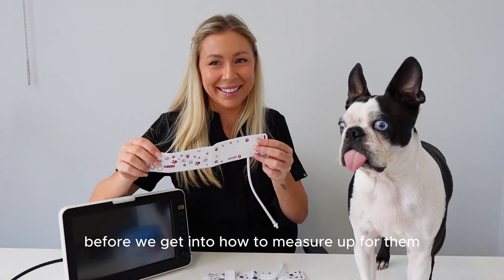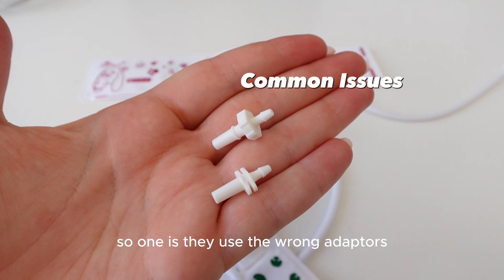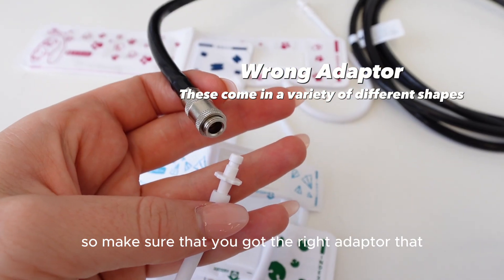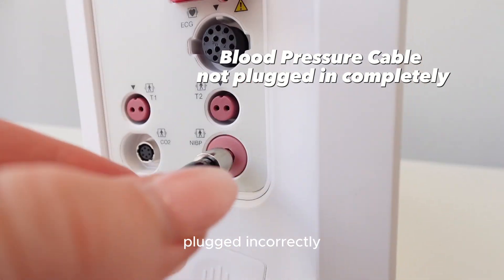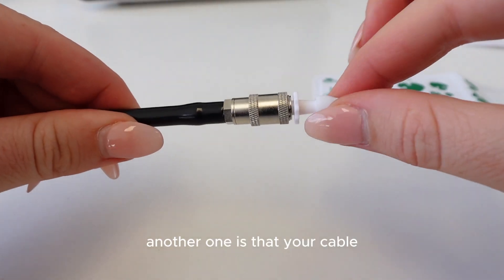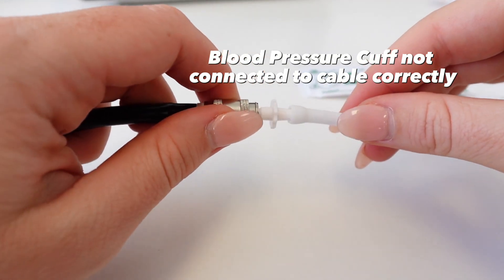Before we get into how to measure up for them, let's go over some common issues people experience. One is using the wrong adapters when ordering blood pressure cuffs — make sure you've got the right adapter that suits your monitoring machine. The second is not having your blood pressure cable plugged in correctly. It happens more than you think, so just check that.